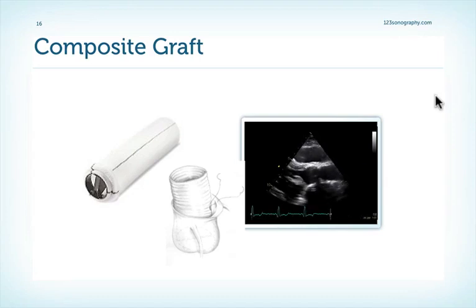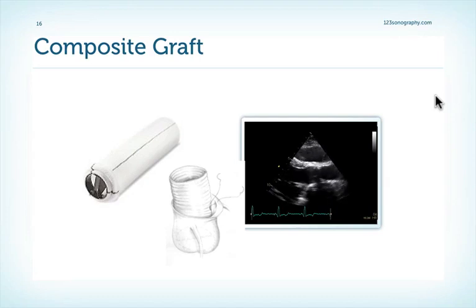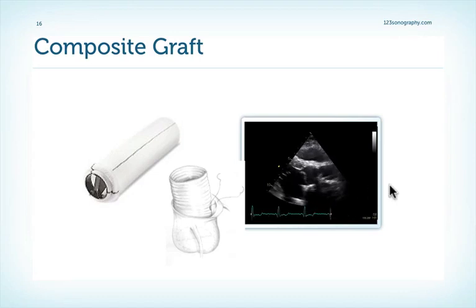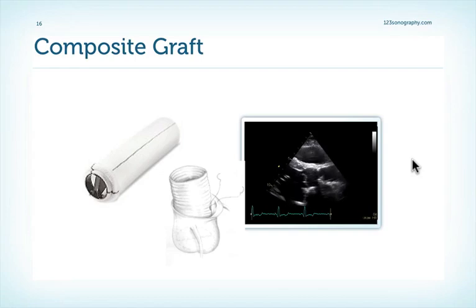A composite graft is characterized by a mechanical prosthesis with typical shadowing and the Dacron structure of the ascending aorta. The aortic root is usually very thick, and you can appreciate the bright echoes and the zigzag structure of the wall of the tube graft. In reality, it's very difficult to really see the tube part of the graft and we can easily miss it. Therefore, we have to rely on the correct referral diagnosis and information as to what has been operated.